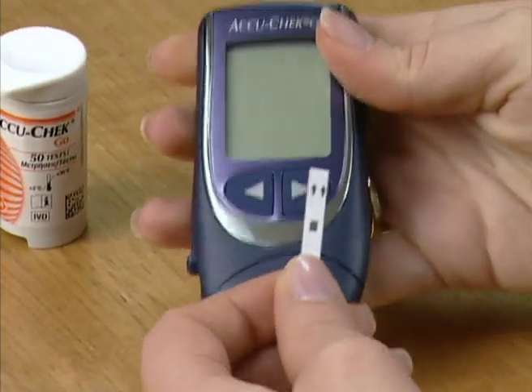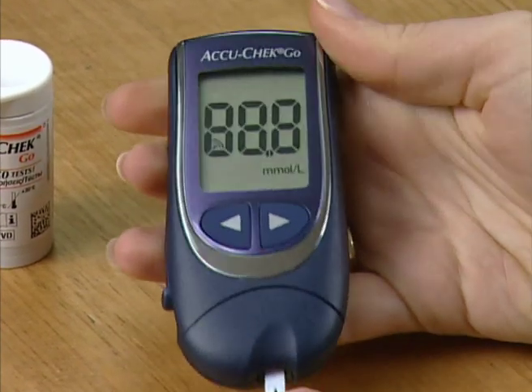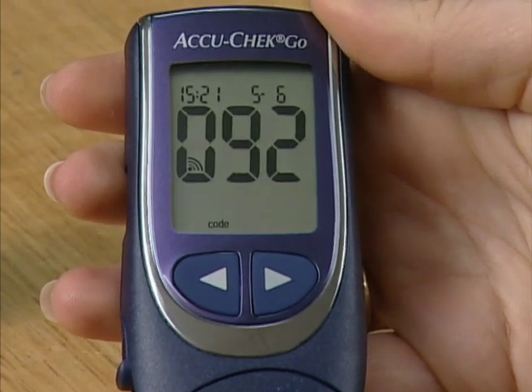To run a blood glucose test, insert an AccuCheck Go test strip into the meter. When the strip is engaged, the meter will turn on automatically.